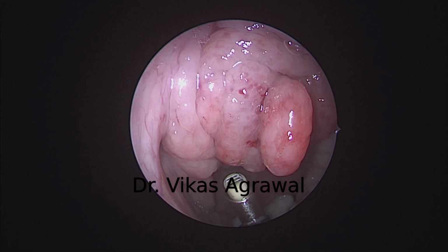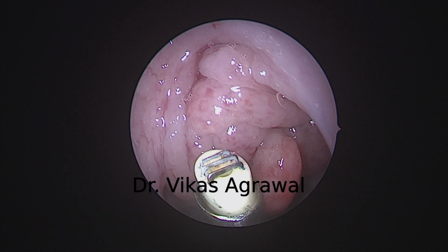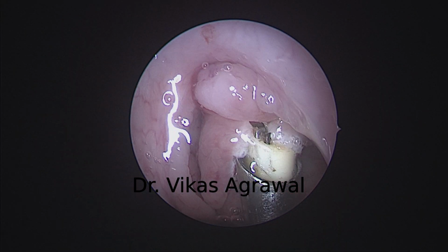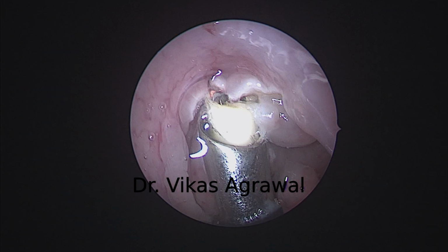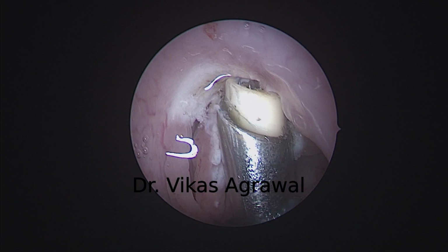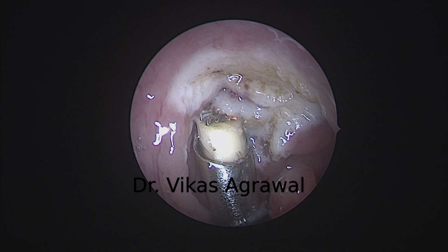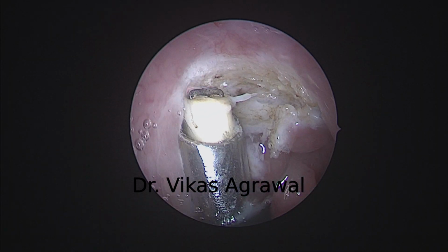So you start with coblation at the setting of 9 for ablation and 3 for coagulation, 3 or 4. I have already done intracapsular tonsillectomy for this child, and I'm starting with the upper pole of the adenoid, which is the buccopharyngeal fascia, which is the periosteum below the sphenoid bone.